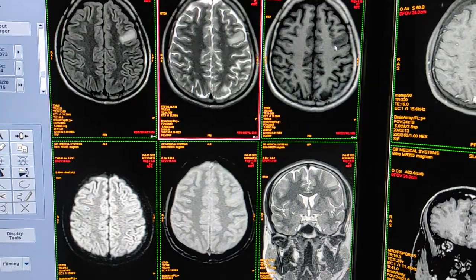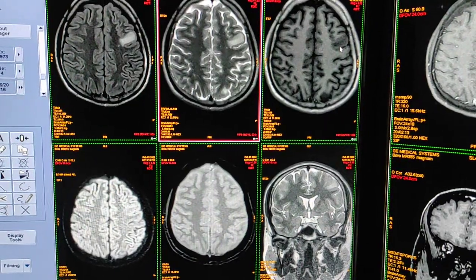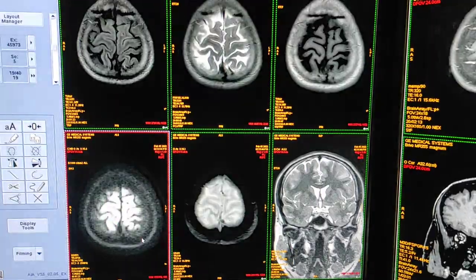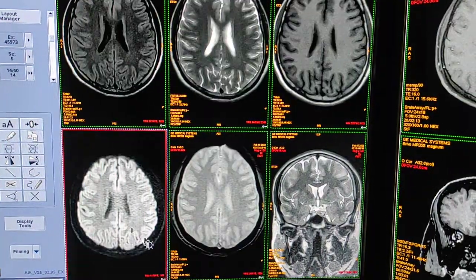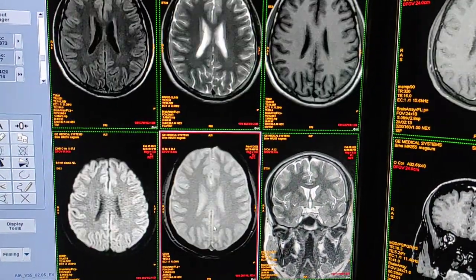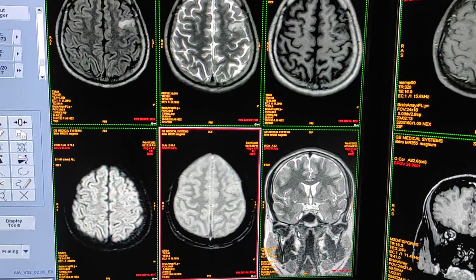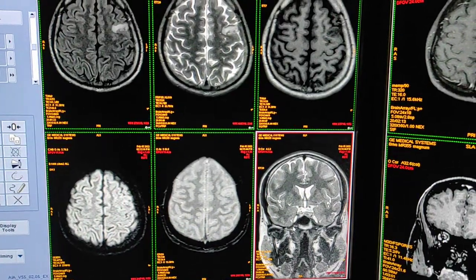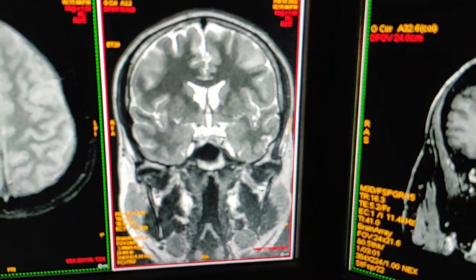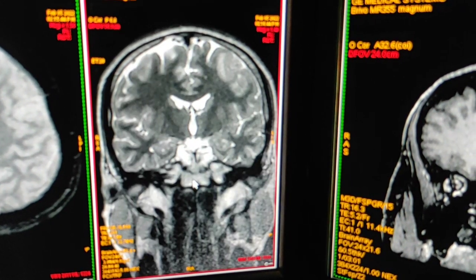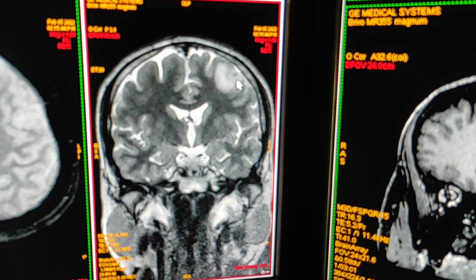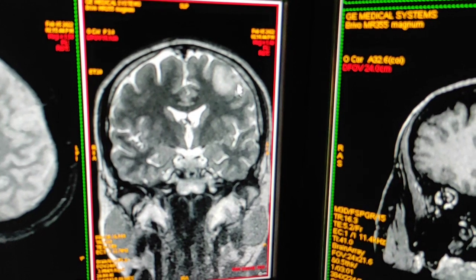The third sequence is hypointense on T1. Fourth, this is DWI. Fifth, this is GRE. Then I have taken thin T2 sections — here you can see a hypointense area; this is a granuloma.